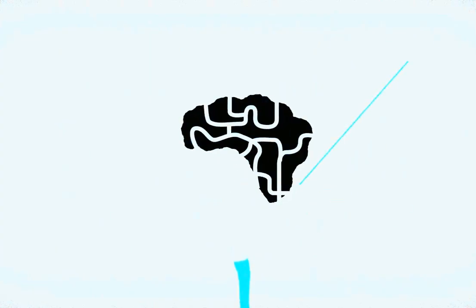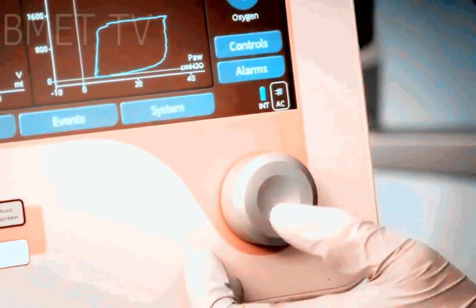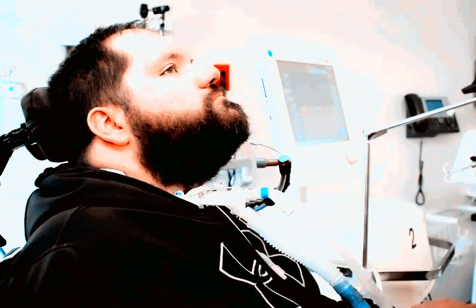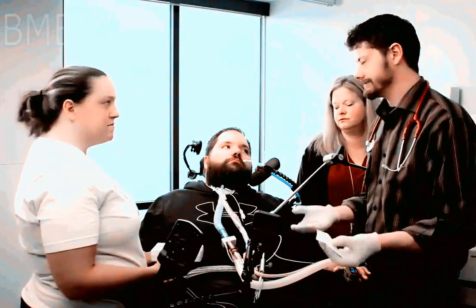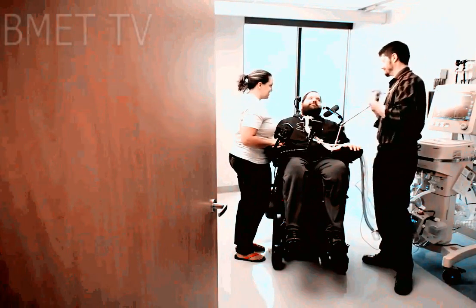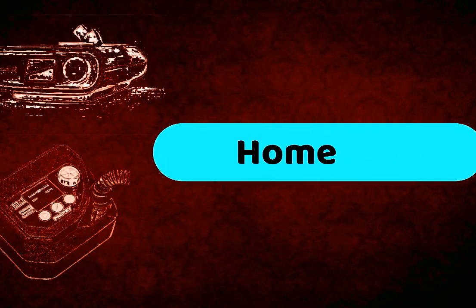Let's begin with hospital care ventilators. Apart from its supportive role in patients undergoing operative procedures, mechanical ventilatory support is indicated when spontaneous ventilation is inadequate for the sustenance of life. The word support bears emphasis, for mechanical ventilation is not a cure for the disease for which it is instituted. It is at best a form of support, offering time and rest to the patient until the underlying disease processes are resolved. Results with mechanical ventilation are consistently better when mechanical ventilatory support is initiated early and electively, rather than in a crash situation. Most hospital care ventilators are used for ICUs, emergency trauma, or patients suffering from hypoxia or hypoventilation. Let's move on to home care ventilators.